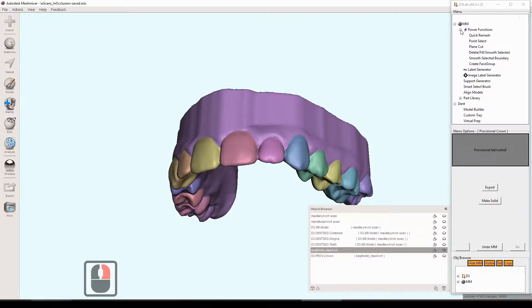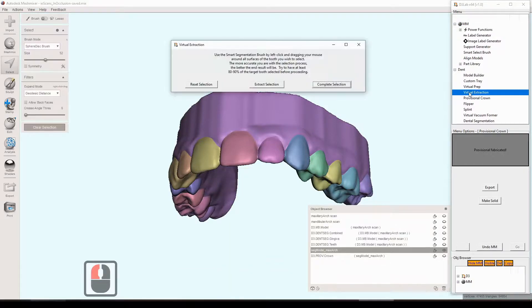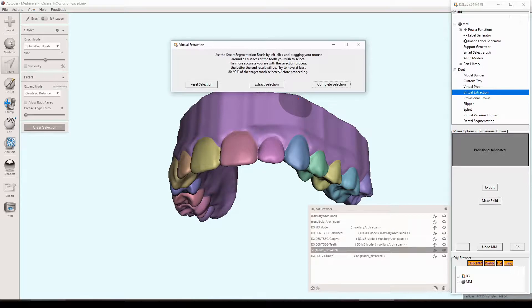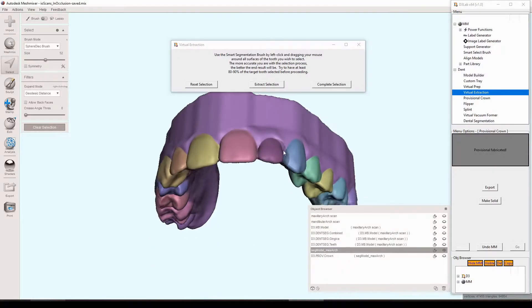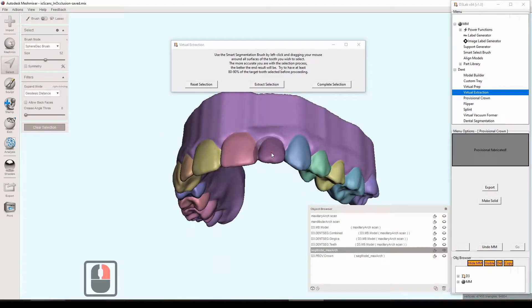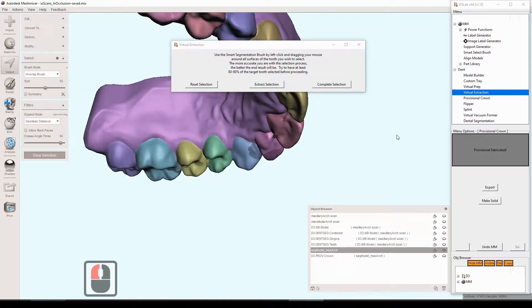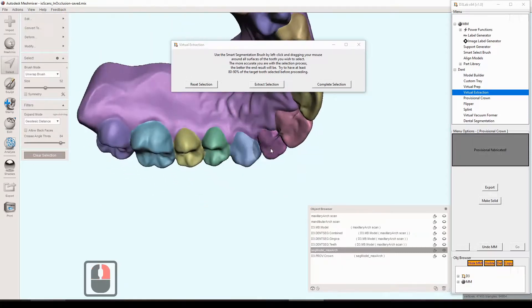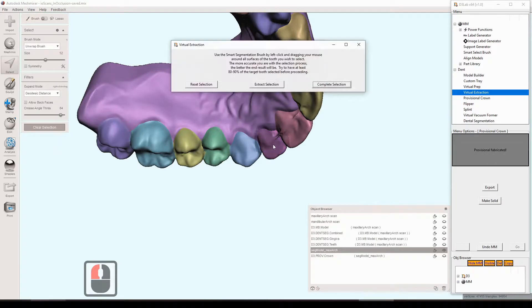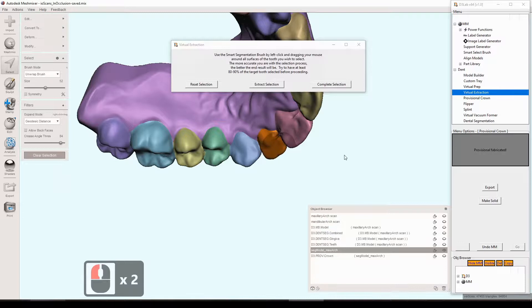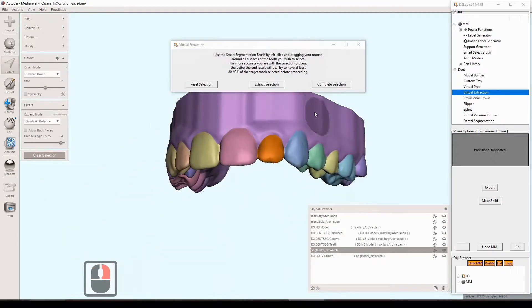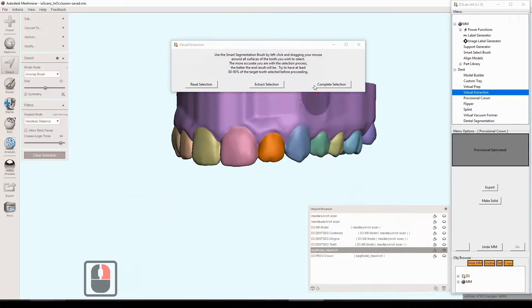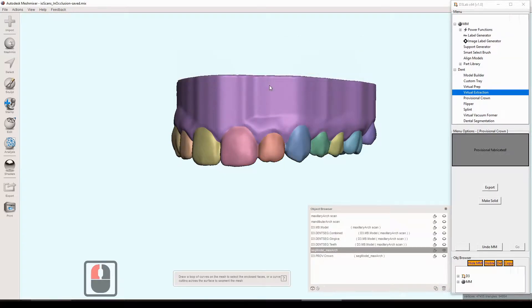So the next thing, the next tool I guess we can get into here is the virtual extraction. Click that and then a prompt shows up. And at this point, the smart select brush will already be ready to go. It's already the filters are ready. It's just going. So if you wanted, you could just use this. If it wasn't pre-segmented, you could just kind of click around here and do your selection to get that tooth. But in our case, again, it's already there. Segmented face group. So we can just double click and we would typically do the complete selection. But in our case, we don't need to. So we'll just do extract selection.